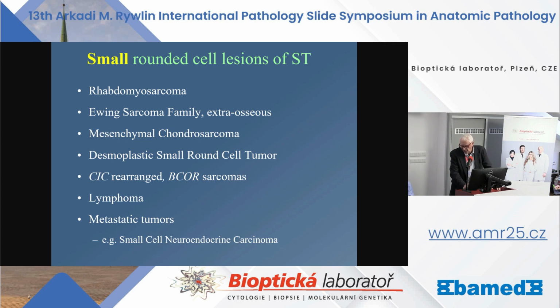Moving on to the malignant small rounded cell tumor category. And this is a list, a partial list of those entities, as you see here, familiar to all of you, or most of you, I would say.